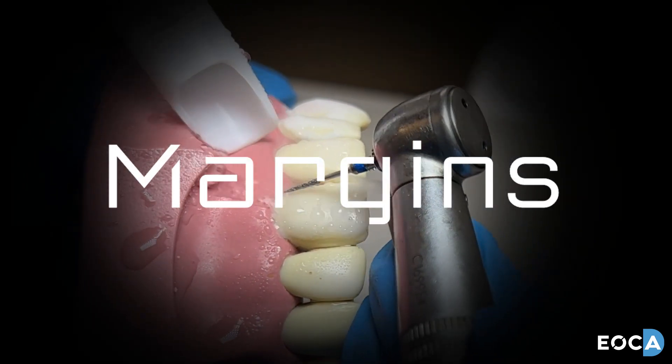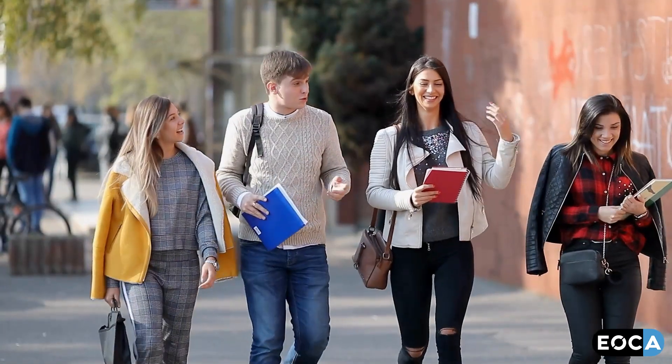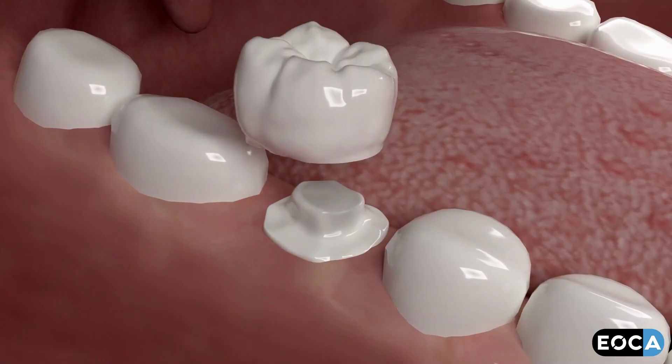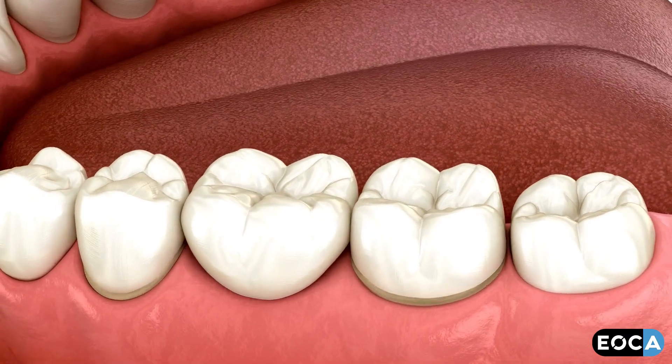Margin Burrs are the world's finest diamonds. All dental students are trained to produce restorations, whether direct or indirect, that have an interface with tooth structure that is undetectable.